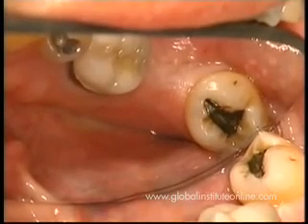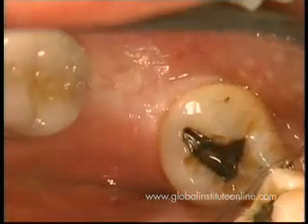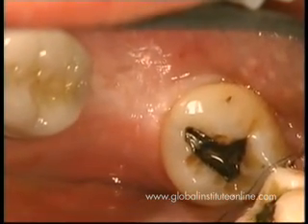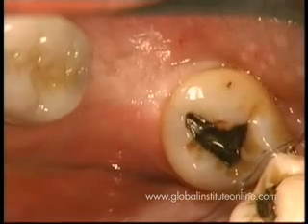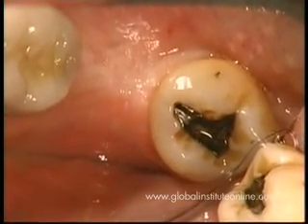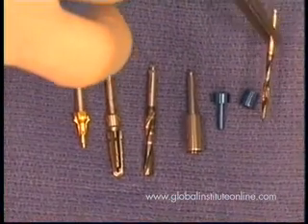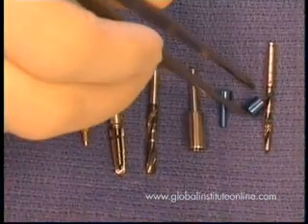Clinically, we see here a sufficient amount of mesiodistal space. We see a sufficient amount of keratinized tissue and a sufficient amount of bone height, which was diagnosed from a radiographic finding. This implant system uses the normal sequence of drills.